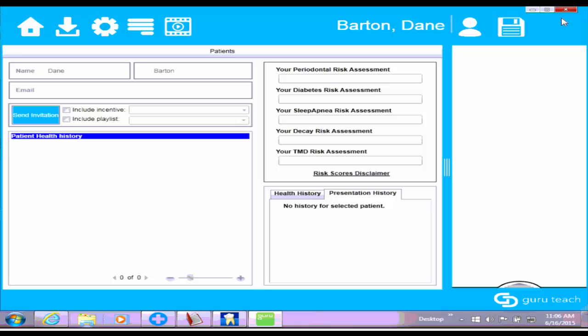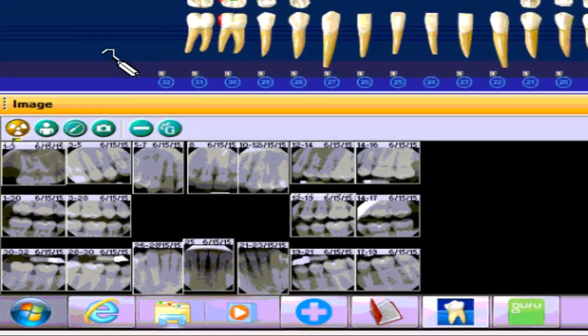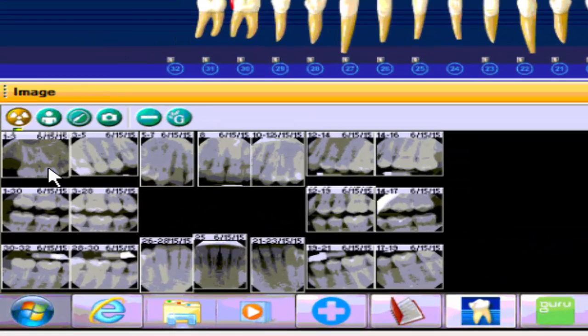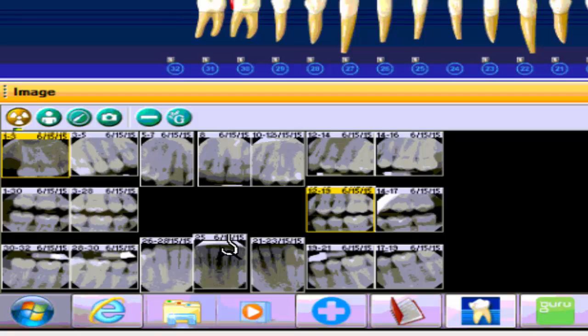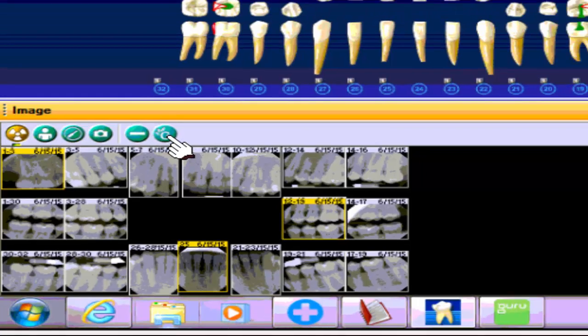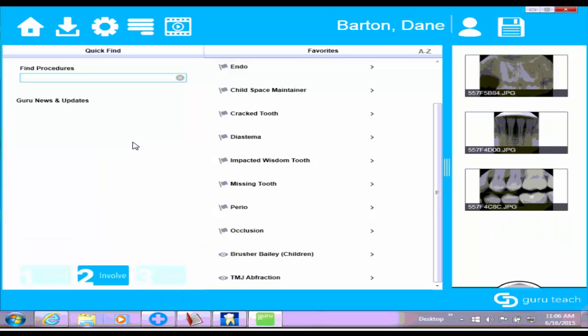The second thing you can do from the patient chart in Dentrix if you are a Dexis user is go to the images. You can select a couple of images that you want to use so that when you click on them they are highlighted yellow. Then if you click this G icon right here, watch what happens.